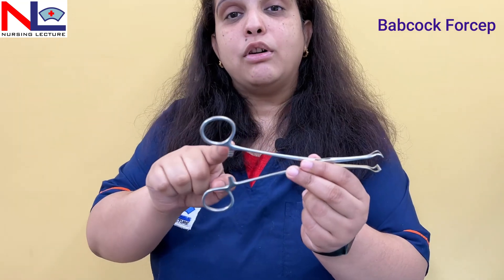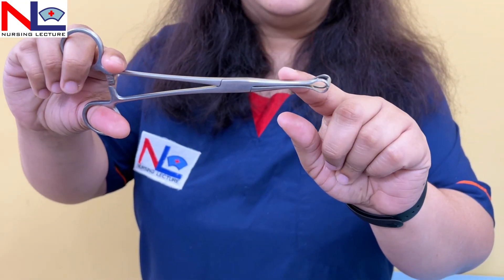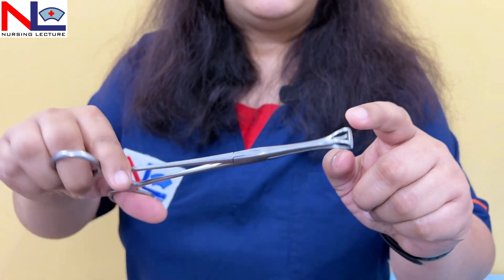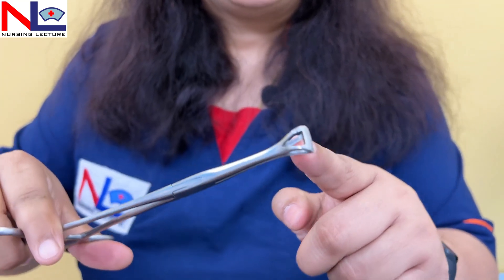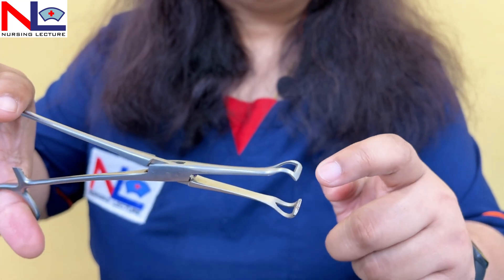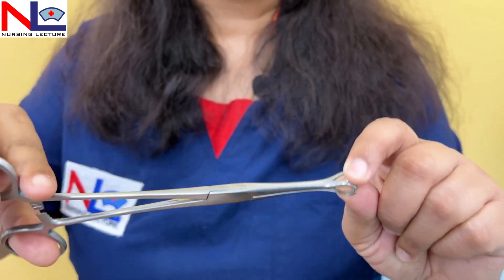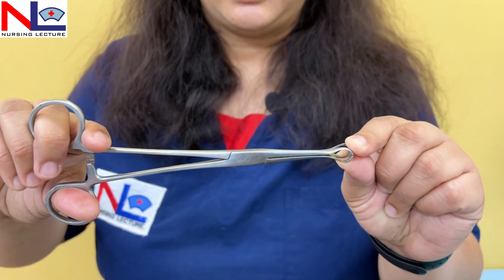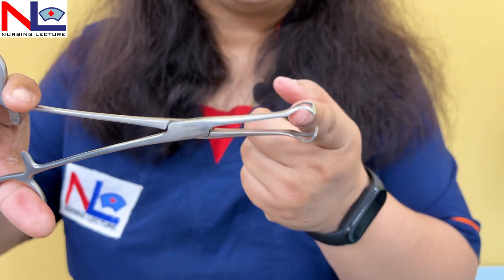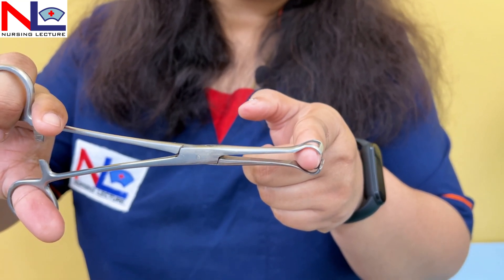The next instrument is the Babcock. As you can see, a ratchet lock is present, and the blades have a specially designed tip with triangular-shaped fenestrations that are circumscribed at the top. Some transverse striations are also present on the tip. This instrument is mainly used to hold tubular structures.